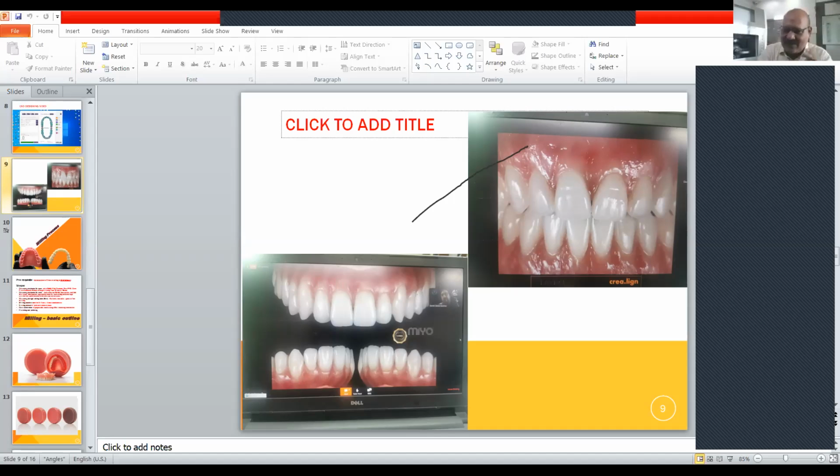So it cannot be repaired or relined. Repairing you don't need because they don't break easily unless you hammer it. And relining is tough, I know, but imagine if the patient is affording it, he is having the quality of denture fit. The quality of fitting is far superior. Now, if you eliminate one possibility of relining, as long as the patient is wearing a good quality fit denture, is he not enjoying his quality of life better compared to that?